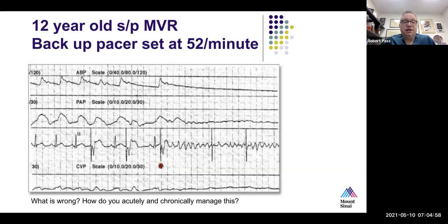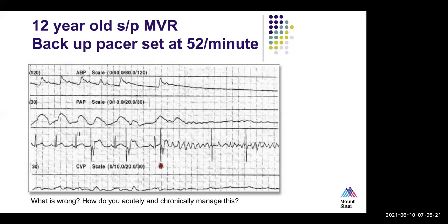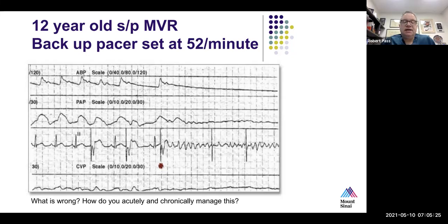Okay, so you've defibrillated the patient. Now, how are you going to prevent this from happening again? Because let's say, just for the sake of discussion, you do need a backup pacemaker. There were some observed non-conductive P waves in the early post-op period of this patient. And so you don't feel comfortable not having backup pacing in this patient. So what would you do to change the sensitivity on the pacemaker, and how would you assess that?